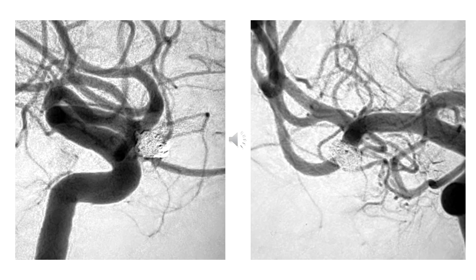There is a small bunch of coil near the neck which we had deposited at the end, and which was ready to fall, but fortunately we deployed the stent in a not very delayed manner, and then we have completed the coiling and stenting procedure of this patient in 2 sessions in a very short gap.